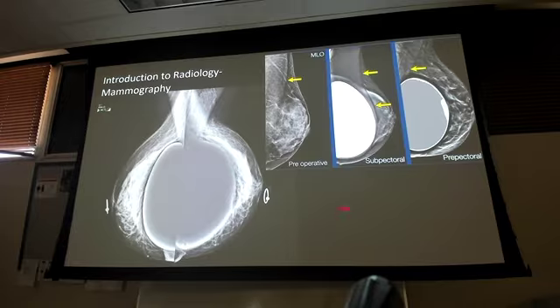Again, foreign bodies that probably should have been removed before the mammogram. But some can't be. Some can't be. Okay? So this is just going to show you, you still order mammos on patients with implants because it's better than nothing. And breast cancer can still present.